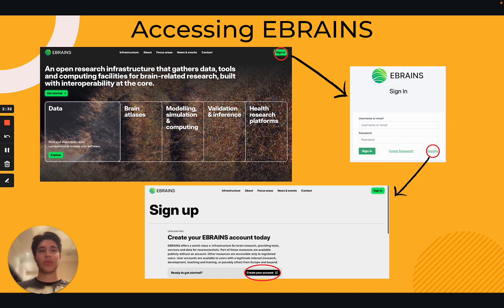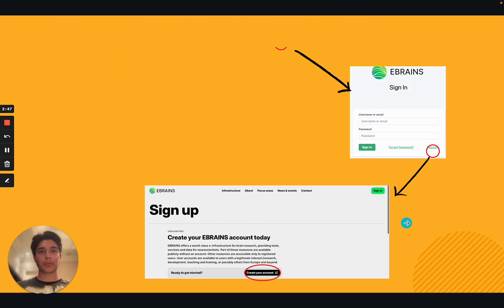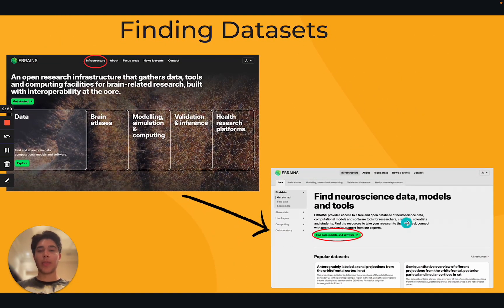After registering, you will receive a registration confirmation email. Click on the link in this confirmation email to be redirected to a sign-in page on the eBrainz website, where you can enter your new login credentials. Once logged in, you will find yourself on the main eBrainz landing page, from where you should click the 'infrastructure' button at the top of your screen. Next, click the green button that says 'find data, models, and software' to be redirected to a page containing the hundreds of datasets offered through eBrainz.